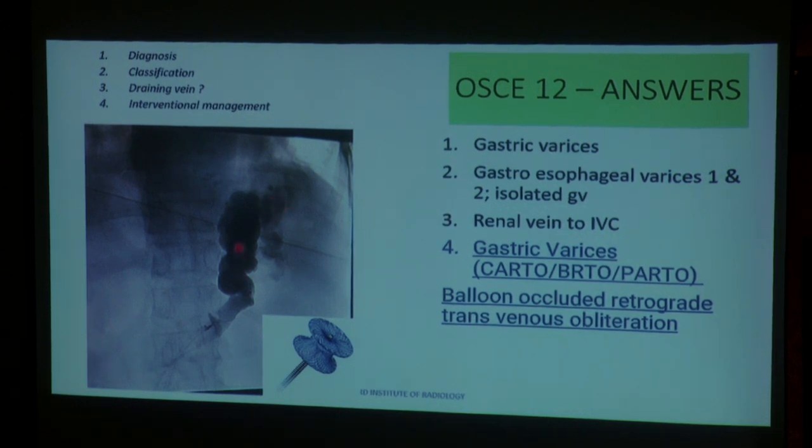So even if your catheter goes here and you inject the sclerosant or occluding agent, because of the fast flow, it will all drain back into the renal vein, IVC, and will reach the lungs. So we have to occlude the draining vein before injecting the sclerotherapeutic agent, and that is why the occlusion can be either by balloon, coils, or the plug.